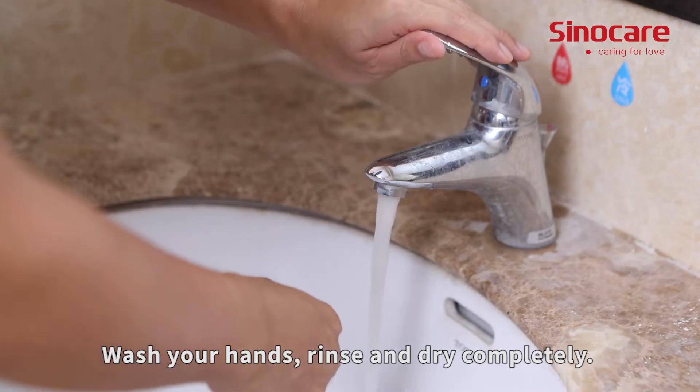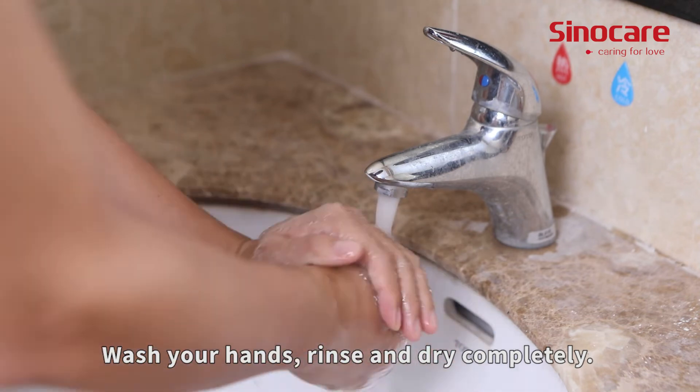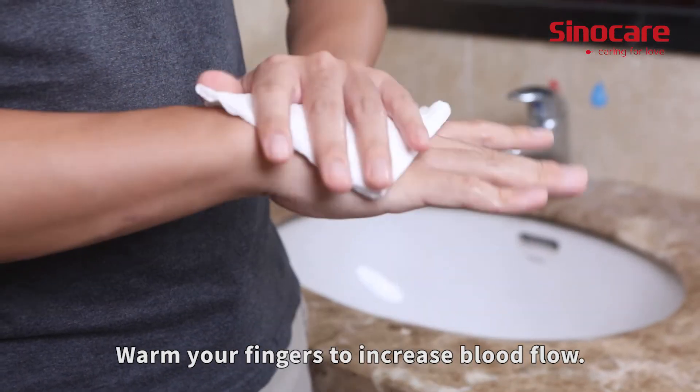Wash your hands, rinse and dry completely. Warm your fingers to increase blood flow.